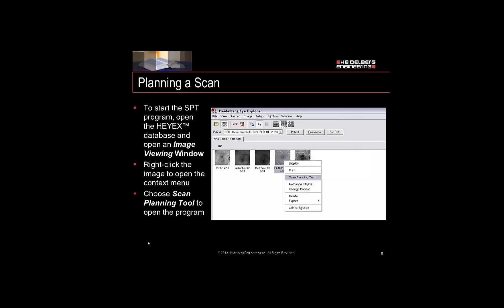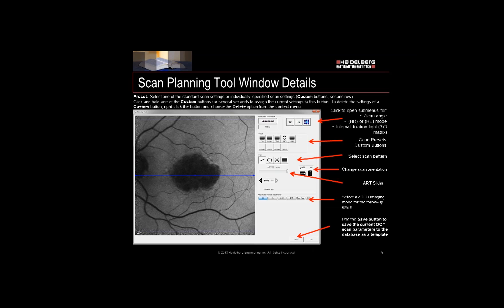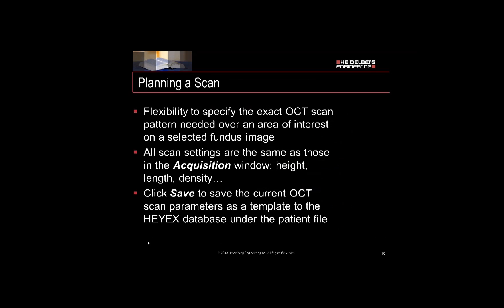So let's review planning a scan. You want to right mouse click on a fundus image and select the Scan Planning Tool to open the program. Once you're in the Scan Planning Tool program, you'll see that the settings are the same as in the Acquisition window and you can build any kind of scan over the fundus image. But remember that the program uses the fundus image as a map for a future scan. So in this image, if you wanted to build a scan over the optic nerve, you would have to select an image where the optic nerve was more centered.